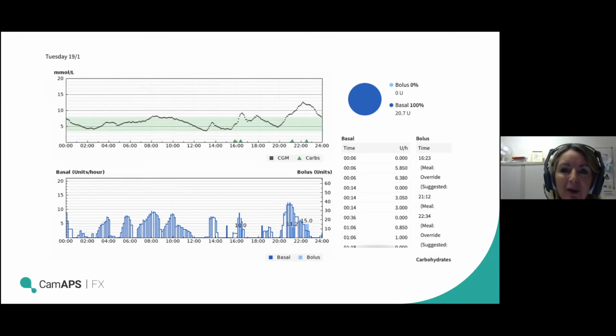And one of the real problems is if women are attached to a sliding scale, it's very difficult, especially if the baby is in the neonatal intensive care, to get breastfeeding started. So I think this ability to keep safe in hospital and reduce the risk of hypos, but also for mums to be able to just focus on their babies and not have to worry quite so much about the glucose levels, has been one of the best bits of it, actually.